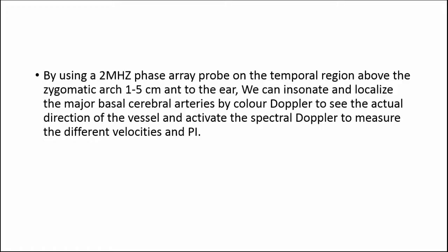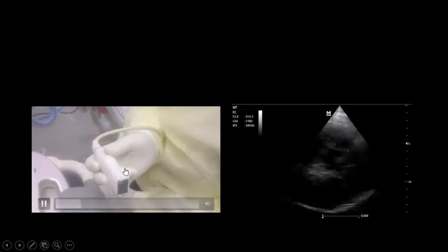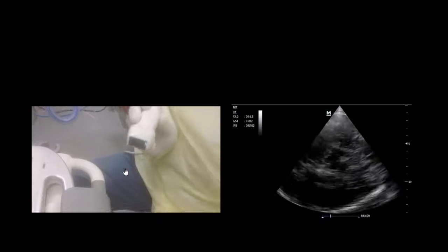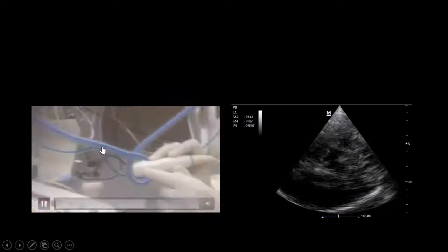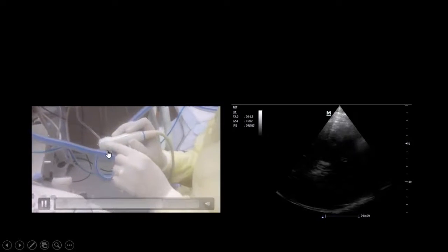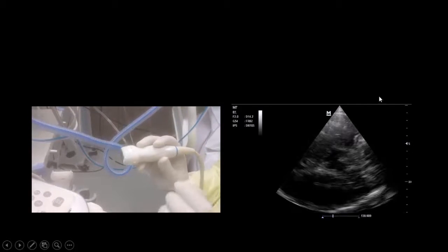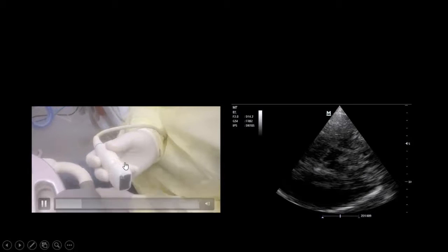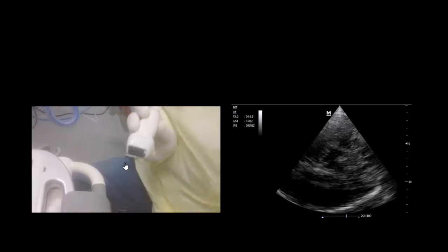Let us see this practically. First, which probe to use — it is simply a phased array probe. You will choose the transcranial Doppler examination from the machine software, which will automatically select 2 megahertz. Always look for the orientation mark on the monitor screen and the corresponding mark on the phased array probe — you must match these marks together to be correctly oriented in space.